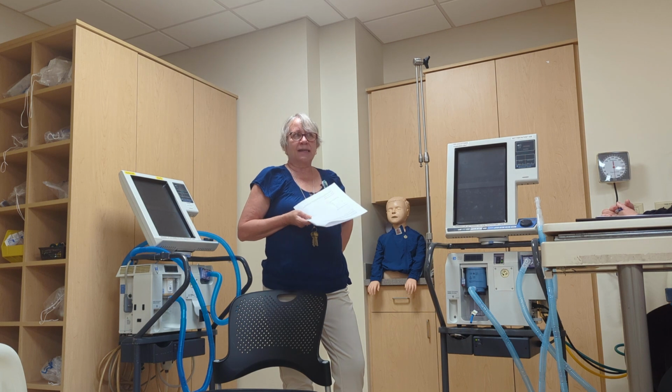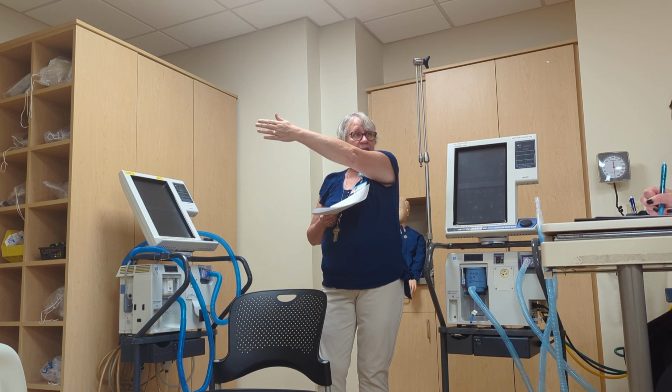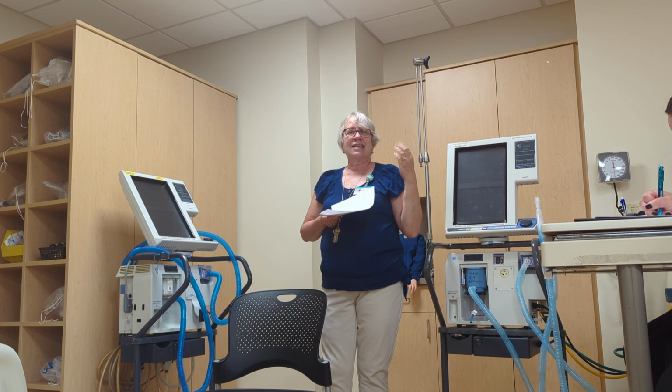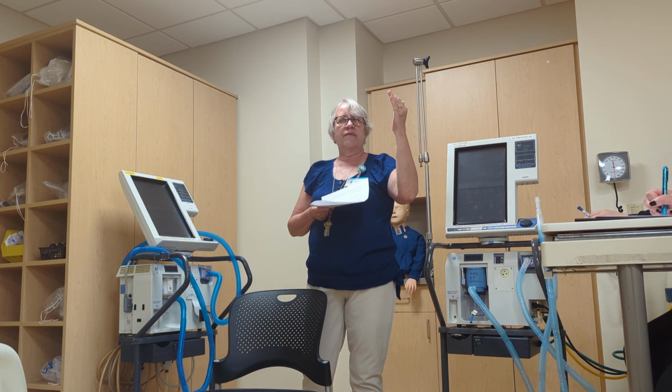You perform that test, so jumping down, you perform that test when you have an inoperable error. That I have to do that. I have to take it down to BMET for that. You do it when it needs to be serviced yearly. So when you're working, you'll see like yearly quality control checks. They need to go down to BMET and have all their internal guts calibrated. So they'll do it yearly, or when you have an inoperable.